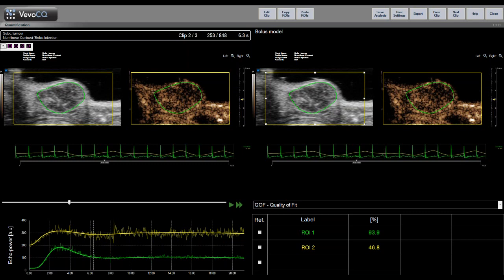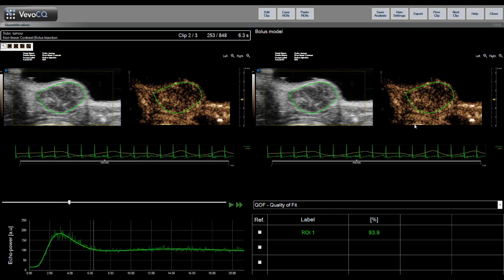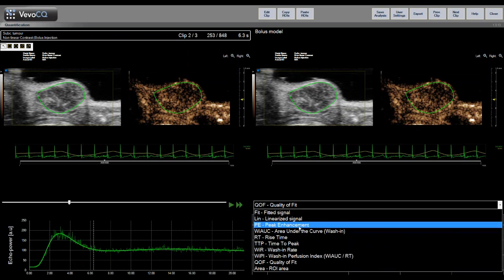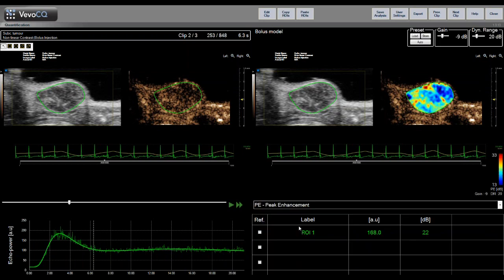the whole. And if you don't want to have this overview of the whole contrast region anymore, you can just delete this region of interest and focus on the tumor that you actually want to study and look at the different parameters for the green region that is my subcutaneous tumor here.